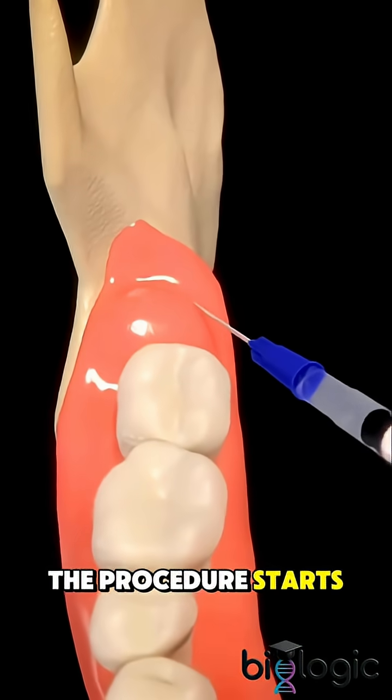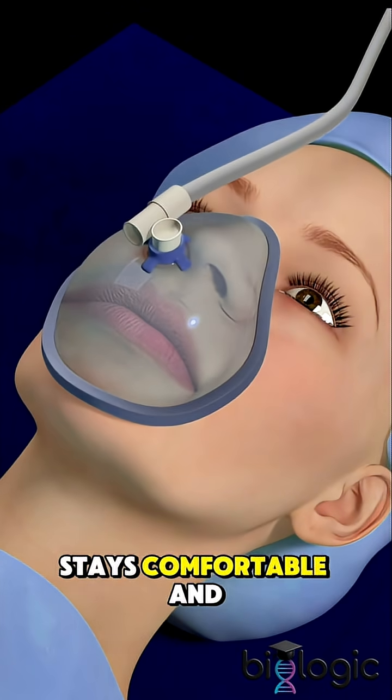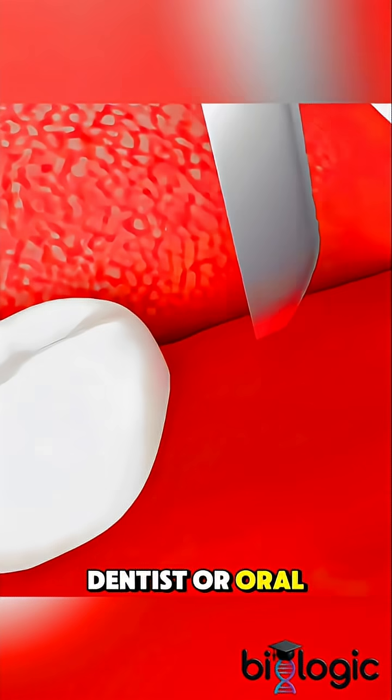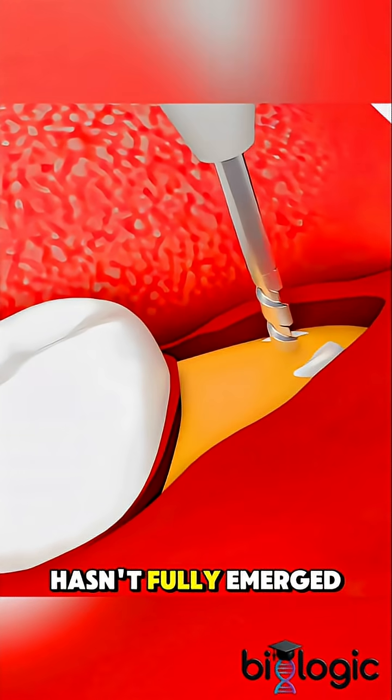The procedure starts with giving local anesthesia, or sometimes sedation, so the patient stays comfortable and pain-free. Once numb, the dentist or oral surgeon makes a small incision in the gum if the tooth hasn't fully emerged.